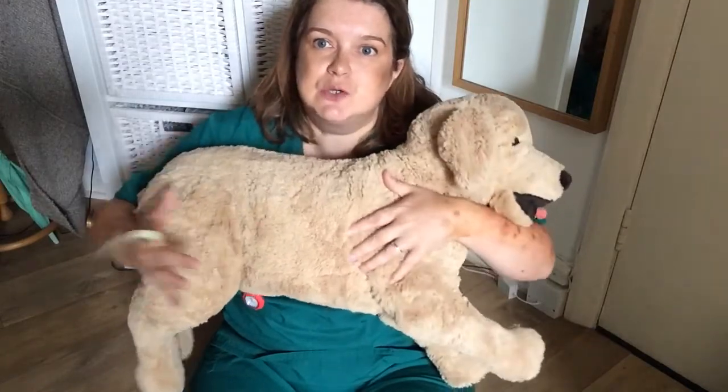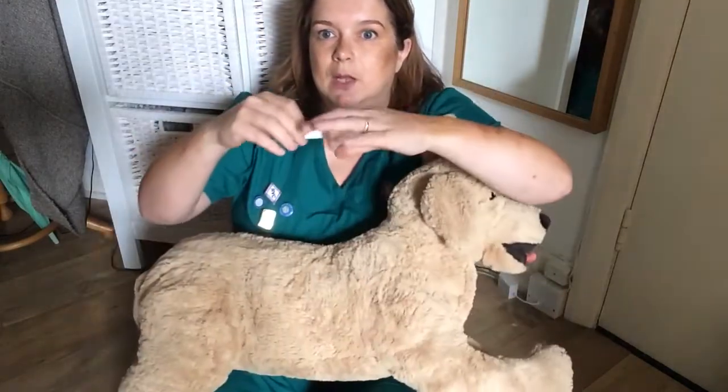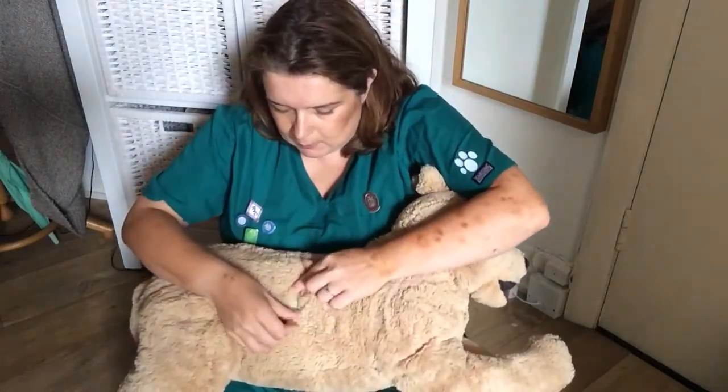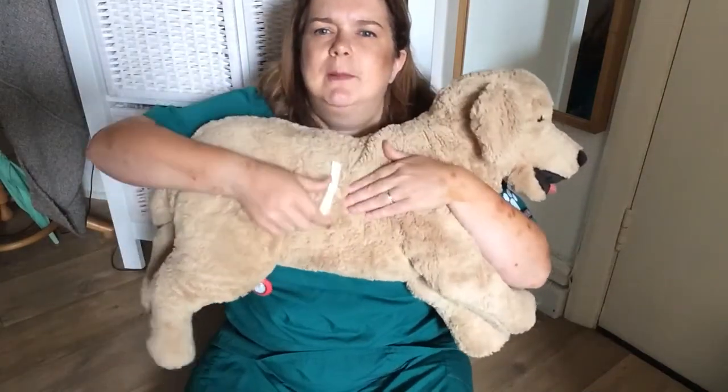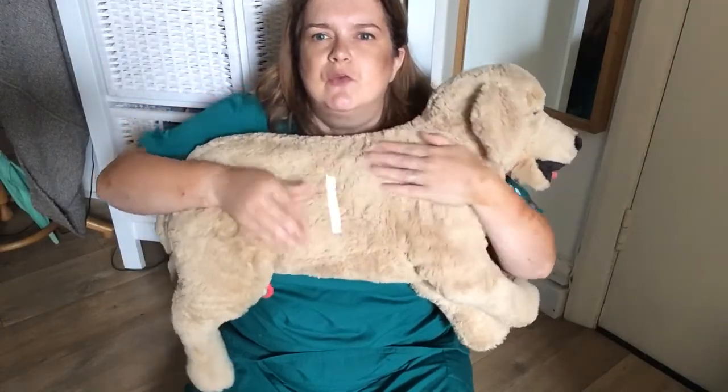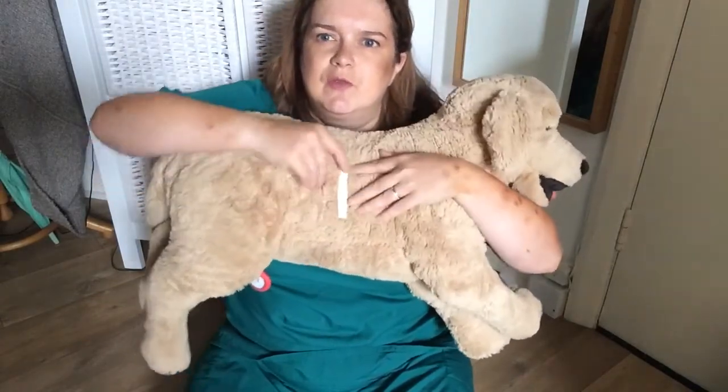We've got front of dog and back of dog. We have a nice little line down here. So if I get my glow-in-the-dark strip, I'm going to go front to back and put that down the middle. I haven't got it hugely visible at the moment but when I turn the lights off you'll see the difference this makes with this patient.